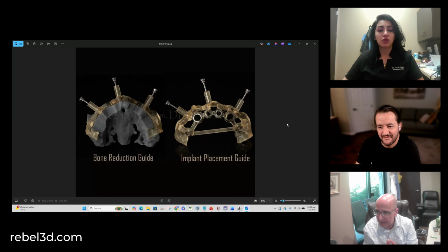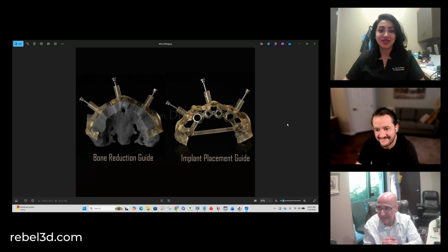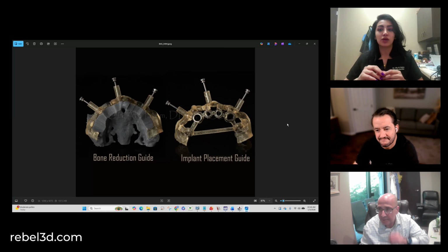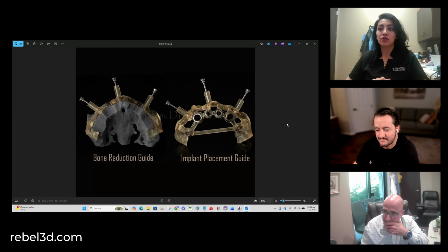And to piggyback on what Dr. Iskandar is saying, I was actually one of those people he mentioned. When I was in residency, whenever you fabricate a surgical guide, you have the option of doing a pilot guide or a fully guided guide. I would go all the way and do a fully guided guide, use all my keys, and make sure the implant goes exactly where I want it. And if I don't get enough primary stability, that's it. I'll just put a cover screw and call it a day. But if you are offering this kind of smile in a day treatment for patients, you want to deliver what you promise, right?